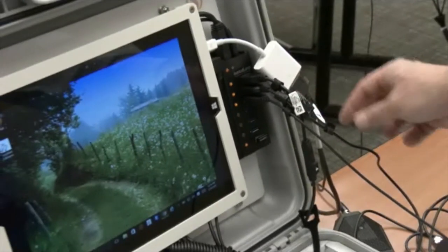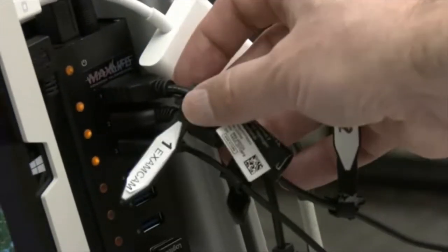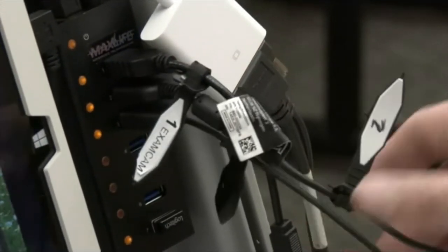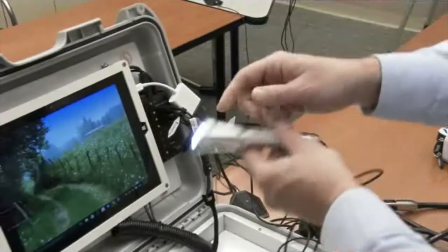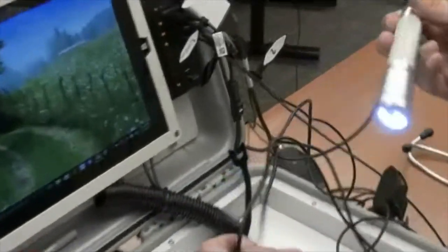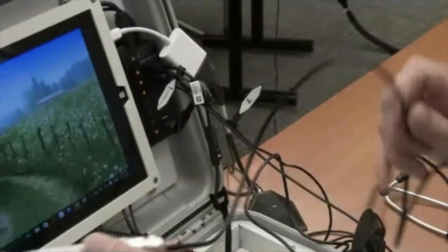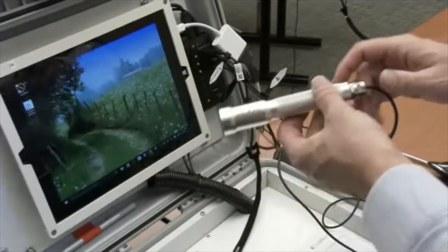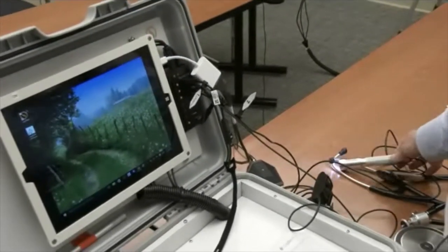Each one of these devices has a number on the side: number one, number two, and number three. The first one is an XAM camera, which is this XAM camera. It has a light on and it does autofocus. We'll be talking about it during the call in a moment so I can show you the features of this camera. The second device is a webcam.